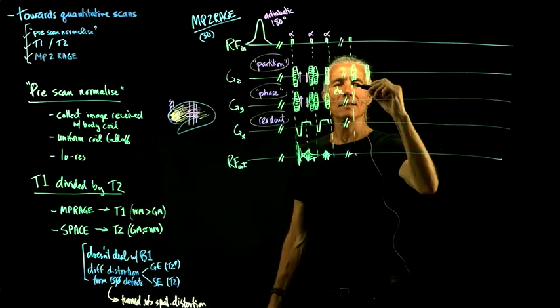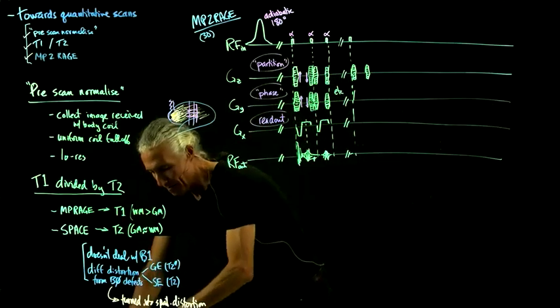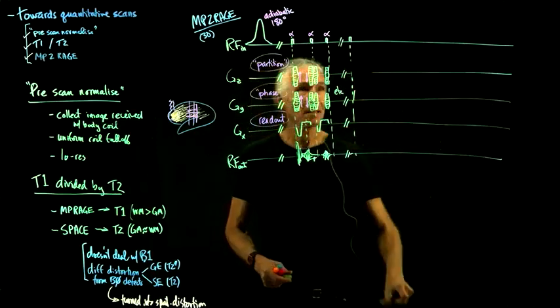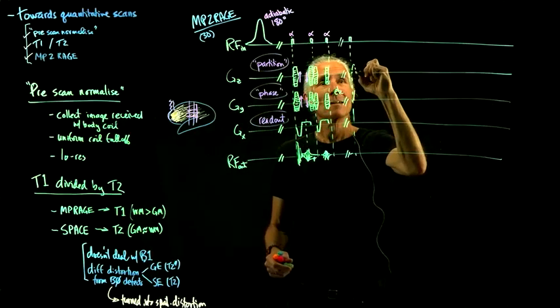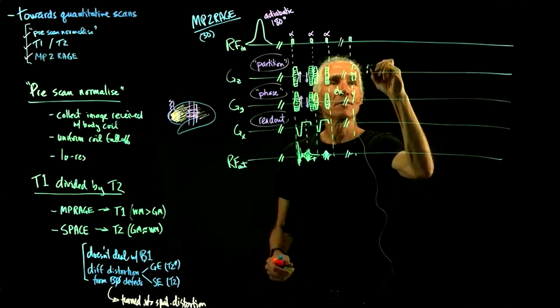And what's the center of k-space? The center of k-space is going to be the middle, right? So it's going to be that one.